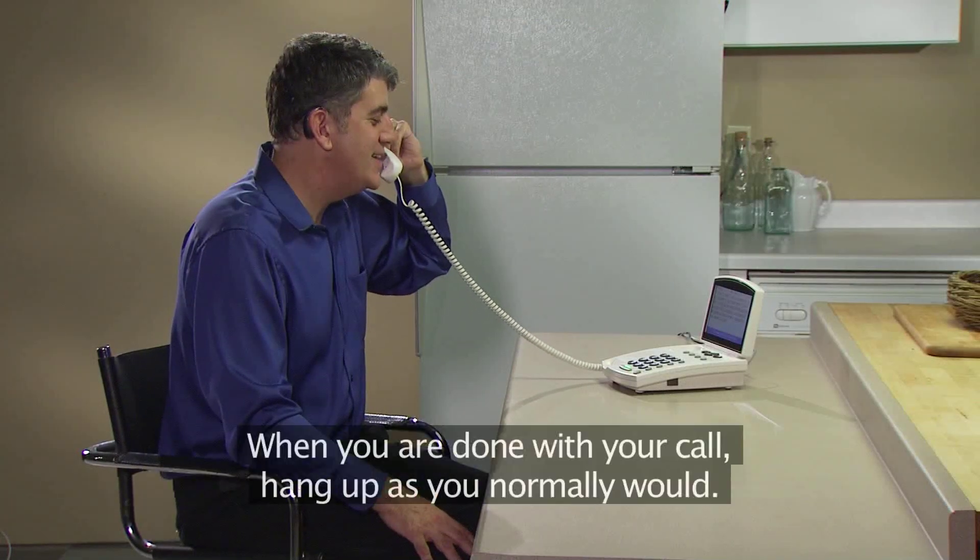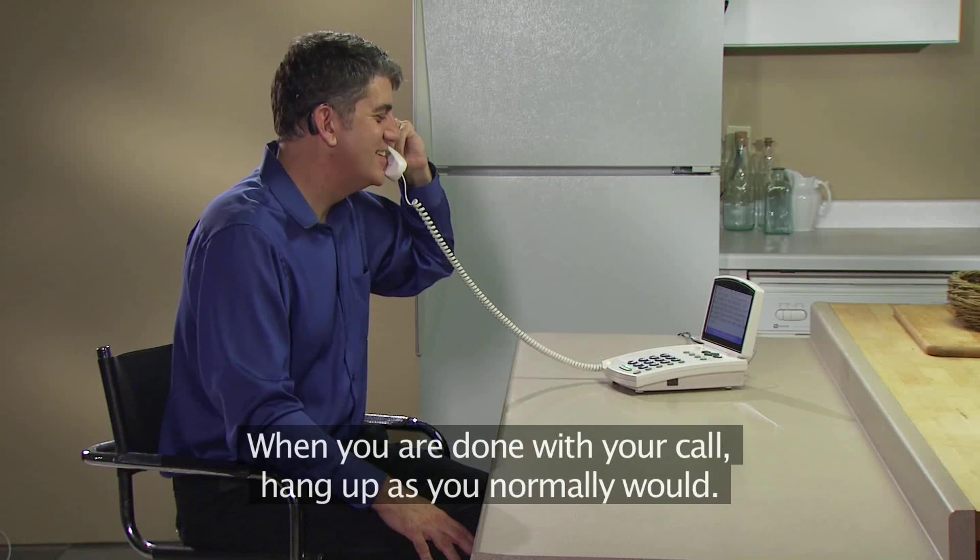Okay, I'll talk to you later. Bye-bye. When you are done with your call, hang up as you normally would.